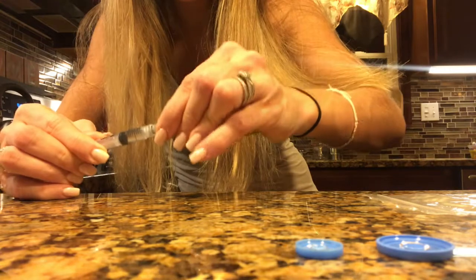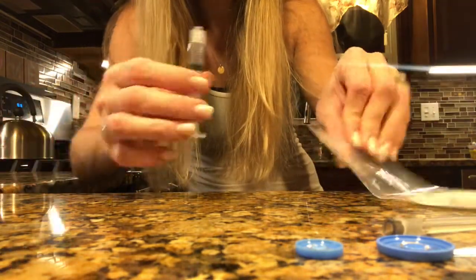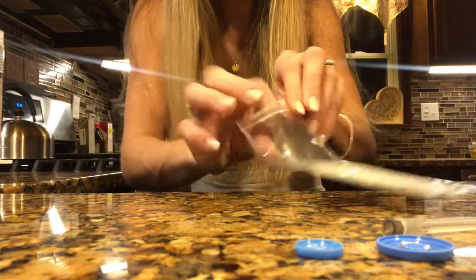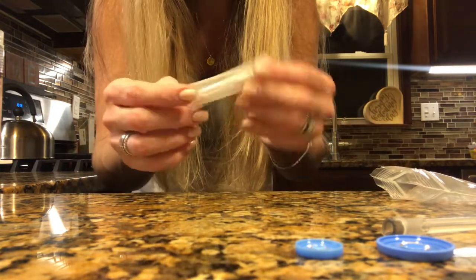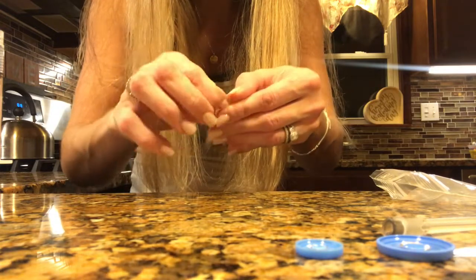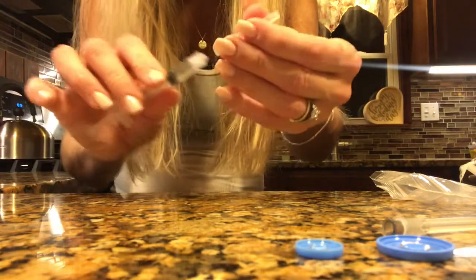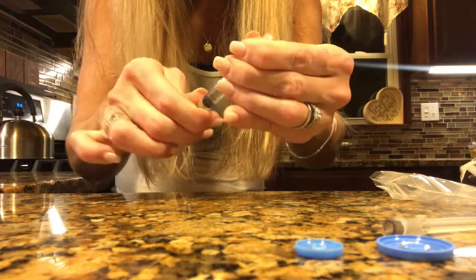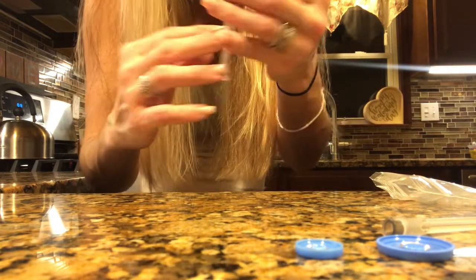When I flip the bottle over there's nothing left in here. Go ahead and recap this needle — at that point you're going to want to switch the needle size. Do not inject yourself with that huge one, it'll hurt like you know what. Grab this little teeny tiny one — it's a nice little needle — and screw that on. Push up a tiny bit until you see a couple drops.